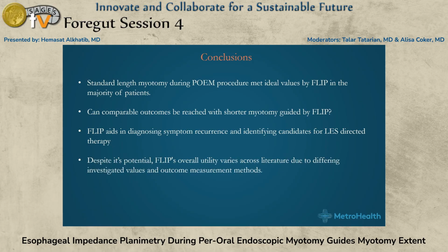And I think very important, despite its potential, the FLIP utility in POEM has been very variable in the studies published, and that's likely because there are different variables that can be used as proxy to measure outcomes.